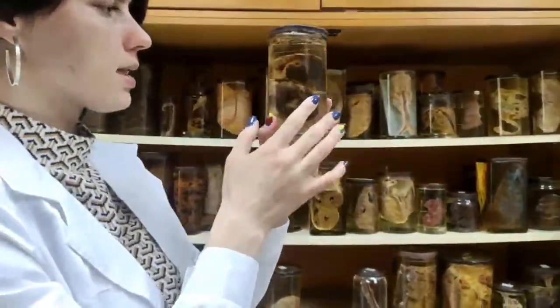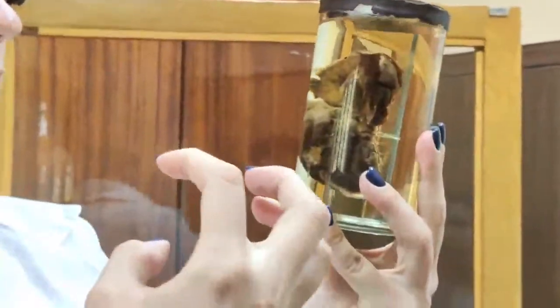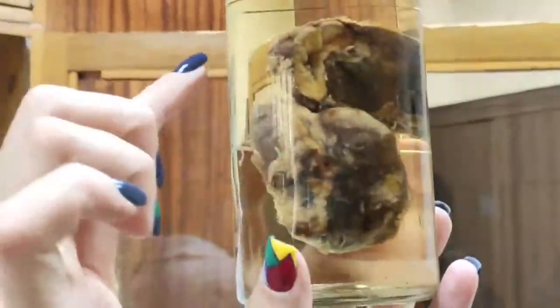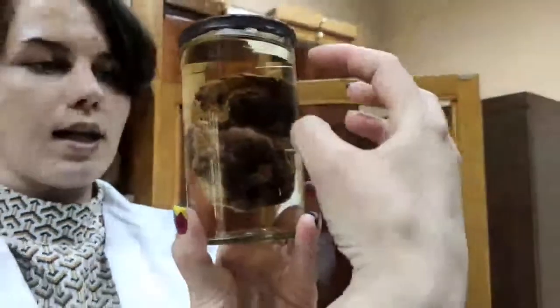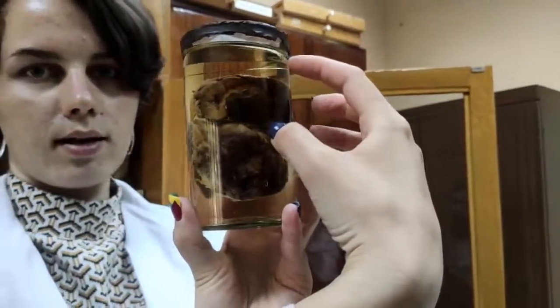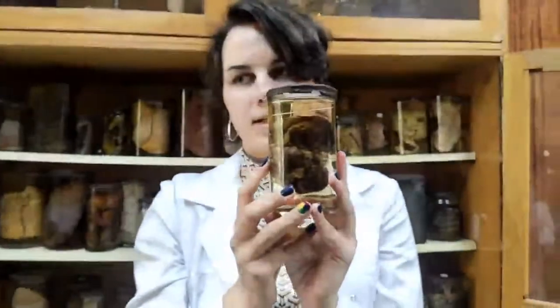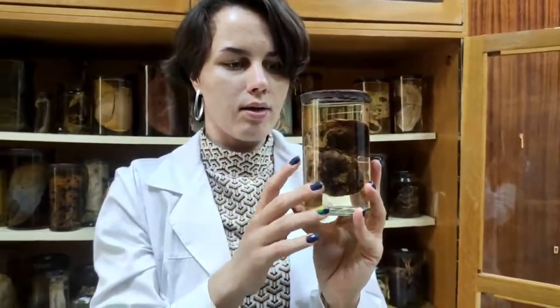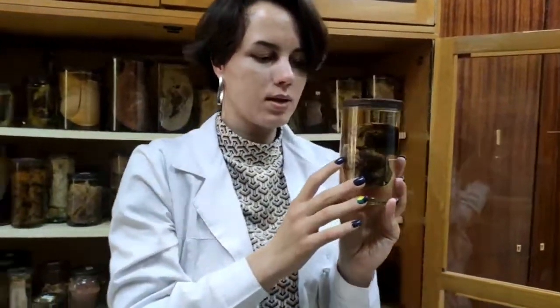The next specimen is bleeding in the adrenal gland, and here you can see a small kidney and a lot of blood in the adrenal gland. This syndrome has its name, Waterhouse-Friderichsen syndrome. It's difficult, but a lot of teachers ask it on the credit, on the exam.